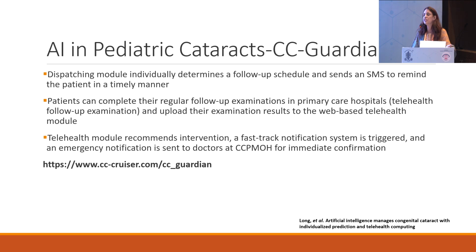So the dispatching module usually determines a follow-up schedule, as I said, and patients can complete the regular follow-up examinations in their primary health settings. They need not visit the tertiary center where they got their surgery done. So this is the advantage of this tool. And these are all the links for how to upload your images for that tool sitting at the periphery.